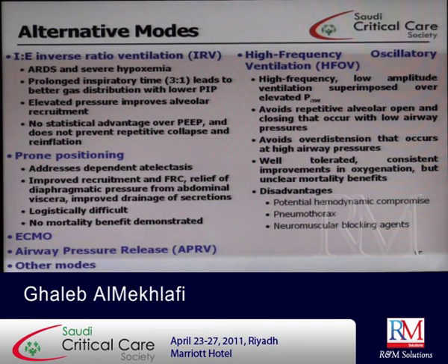And so far, all the studies did not show any significant difference in the outcome in patients ventilated by different modes. Okay. So even those new modes and new, very fancy ventilators, they are more secure, yes, but the modes themselves and the advances in the modes did not show in clinical practice any difference from the old machines and the old modes. Okay, as you can see here, no statistical advantage in this inverse ratio ventilation. Here, no mortality benefits demonstrated.